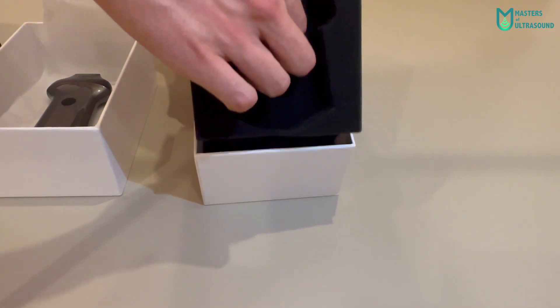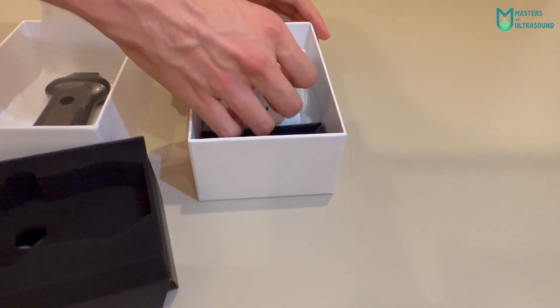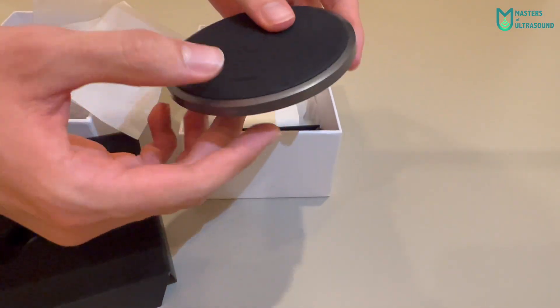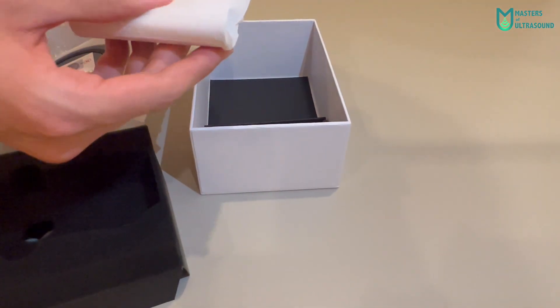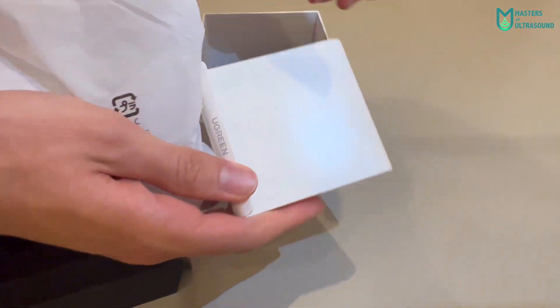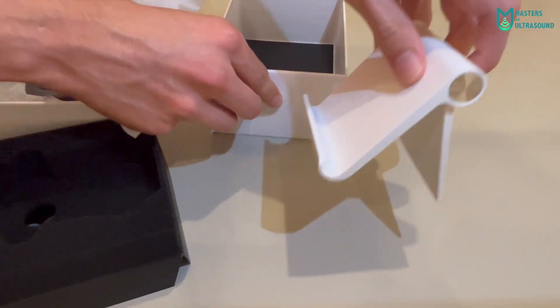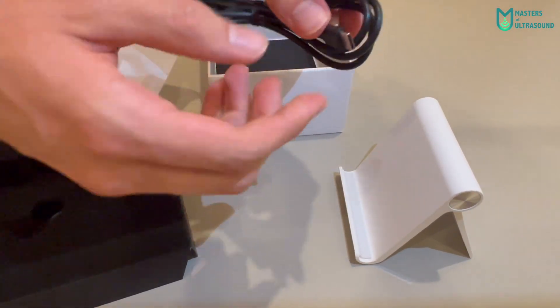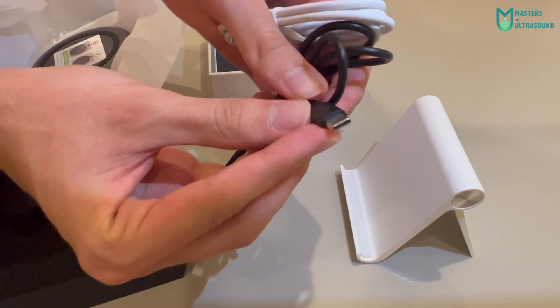Below this black phone there is a USB-C wireless charger. Also, an adjustable stand for the phone or tablet, which is very practical, and USB to USB-C adapters — in my case there are two.